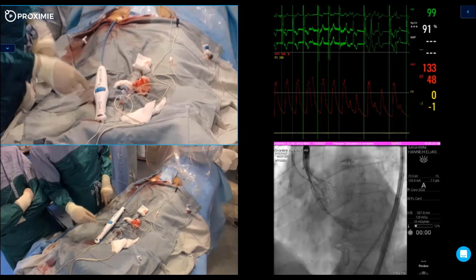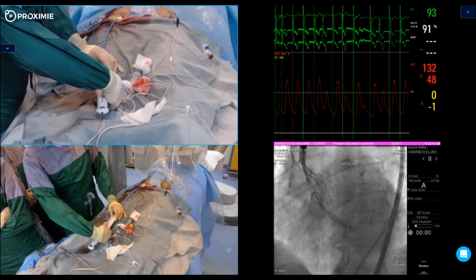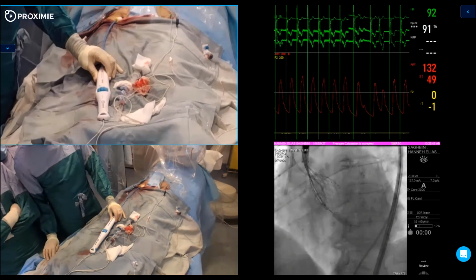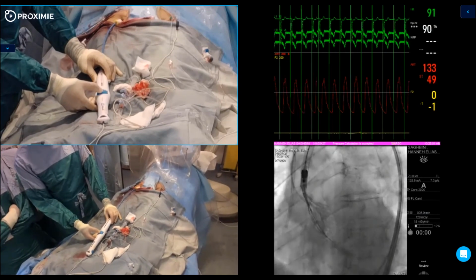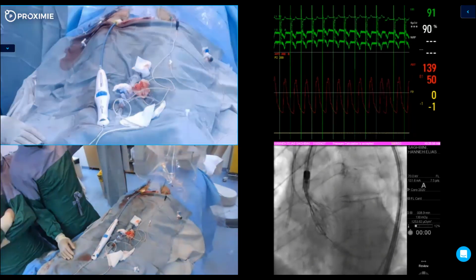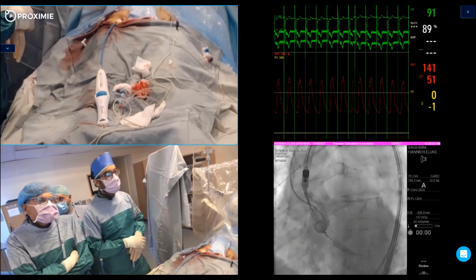Okay. So here, just button. So now we cannot. This is the safety button. Okay, this is safety. So I'm gonna press it, and I'm just gonna unsheath a bit more and wait a bit. Okay. Inject. Okay.